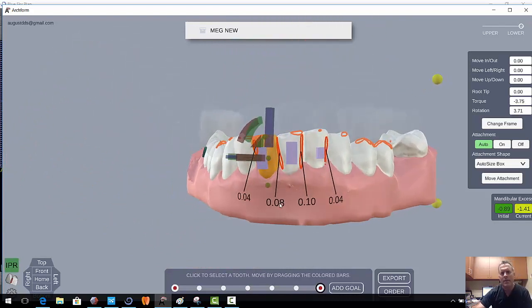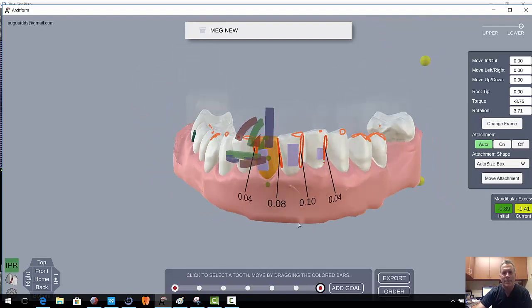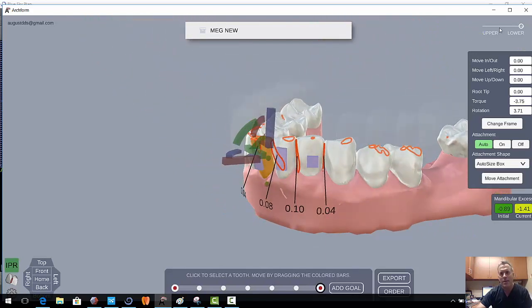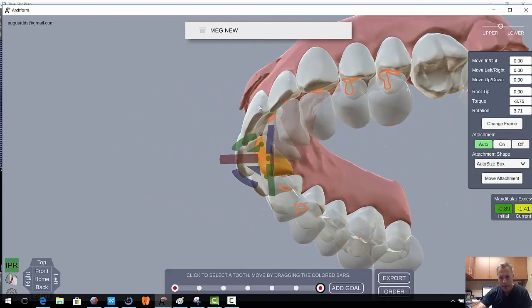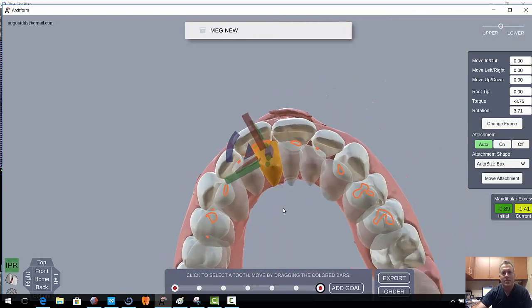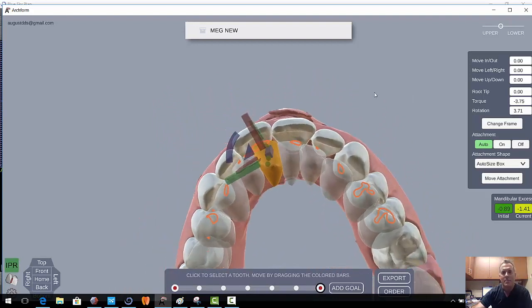So you can see our IPR is actually pretty minimal in between these teeth. Maybe a little bit over here, but not too bad. And so now let's go ahead and turn on our upper and see where we are. So this one gives us a view of the upper and lower teeth together. And so you can see here that the occlusion is pretty minimal, especially around here, but we have it a lot in the anterior. So we may have to do some enameloplasty on those incisal edges.